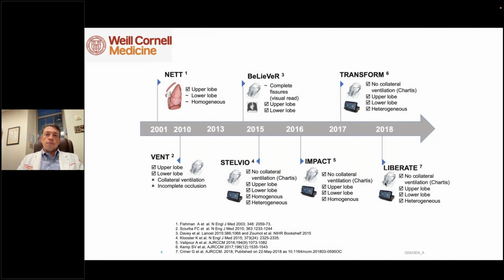As a result of multiple clinical trials, we now have a better understanding of a particular phenotype that may benefit from this procedure, which we will discuss.